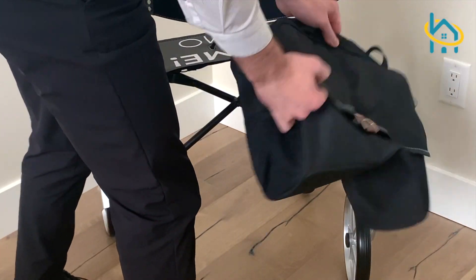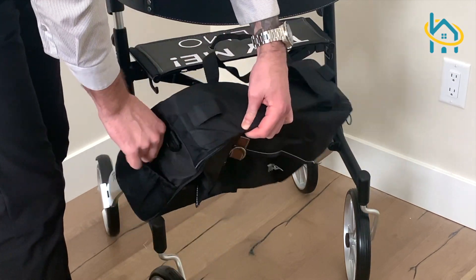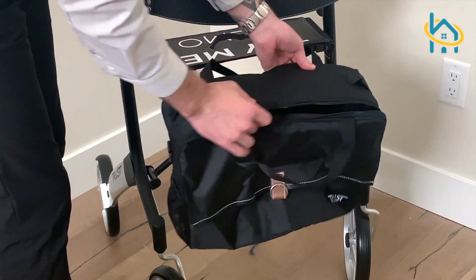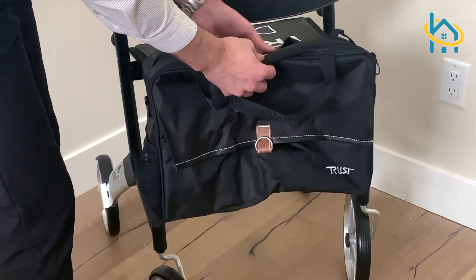This rollator also comes with a convenient carrying bag that has a front pocket and a zipped main pouch. You can use the bag on its own or attach it to your rollator when you're on the go.